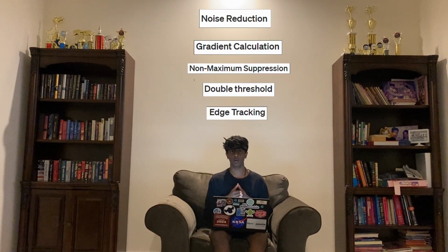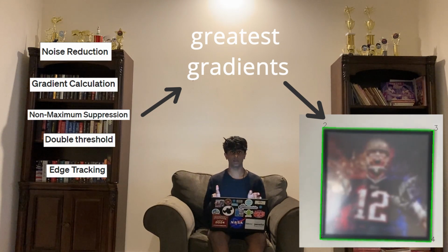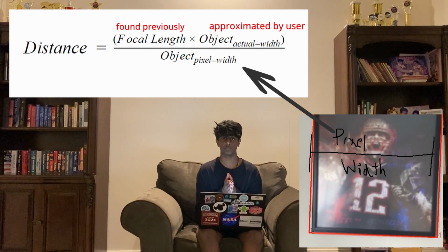How we do that is we find what's called gradients using edge detection. Now, gradients are basically just the greatest contrast in pixels in any image. And we use specifically Canny edge detection, which is a 5-step process outlined up here. Using that process, we will find the greatest gradients in any frame, and then those greatest gradients will be used to create a bounding box. So now that we have the bounding box and our focal length of the camera, we can see how far a user is from their actual object.